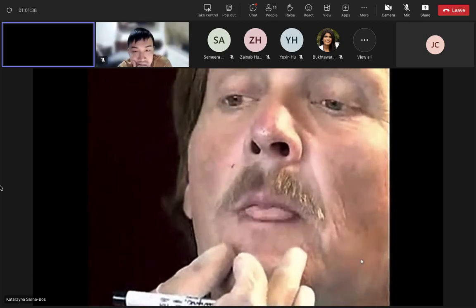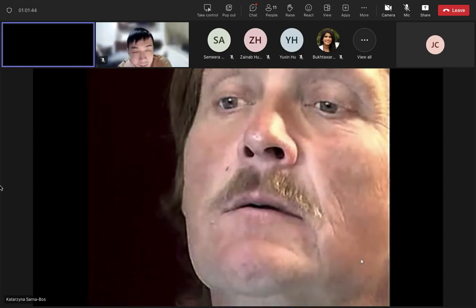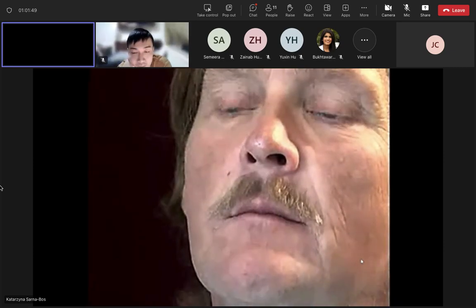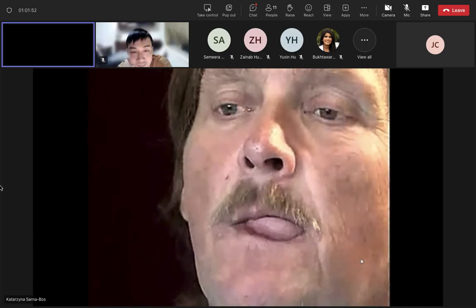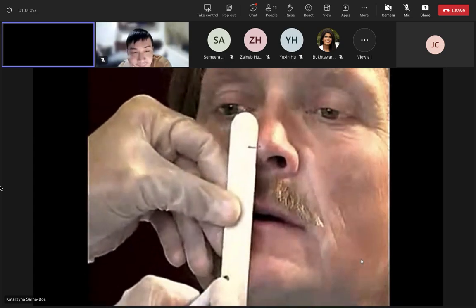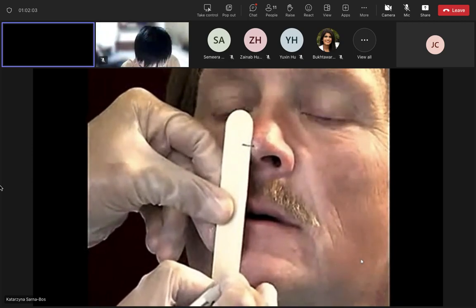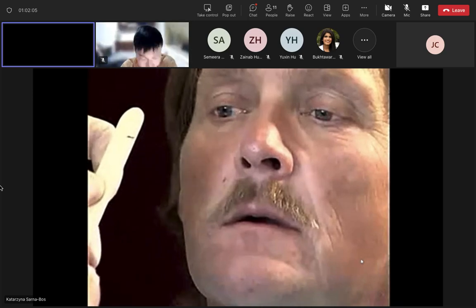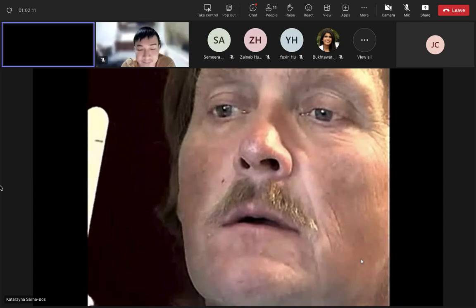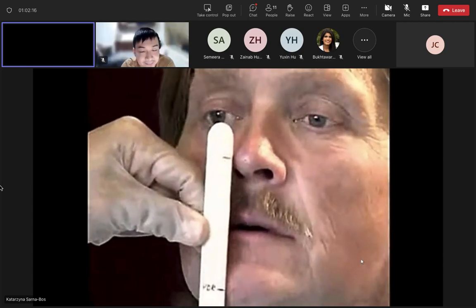Ask the patient to say Emma several times and relax his jaw, or swallow and relax his jaw several times. Use a tongue depressor blade to record the distance between the reference points when the patient's jaws are in the physiologic rest position. This measurement on the tongue blade is the vertical dimension of rest. It should be relatively constant after several repetitions.